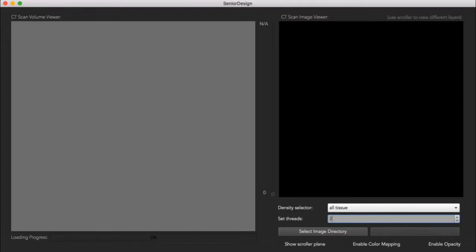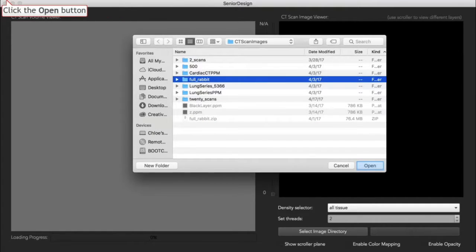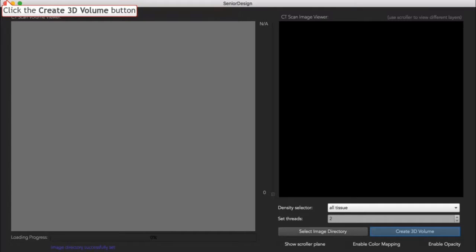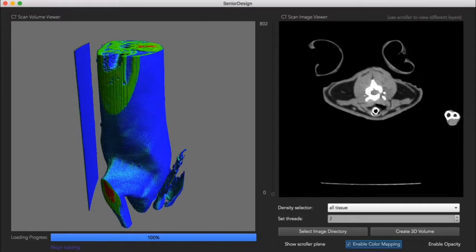To select the image directory that you would like to turn into a 3D volume, you click the Select Image Directory button and select the directory you'd like to open. After opening it, you can set the number of threads that you would like if you want multi-threaded application. You then can click the Create 3D Volume button. The loading progress bar shows the progress of the app as your 3D volume is being built.